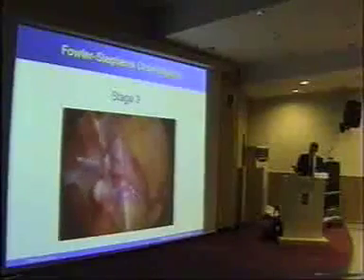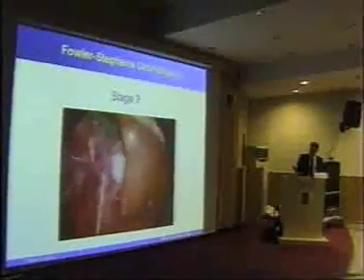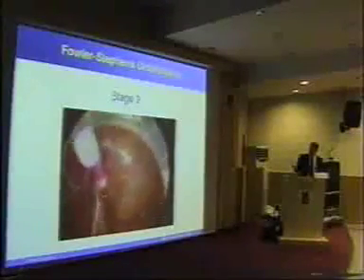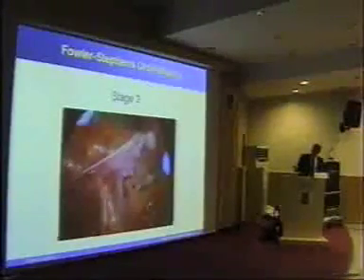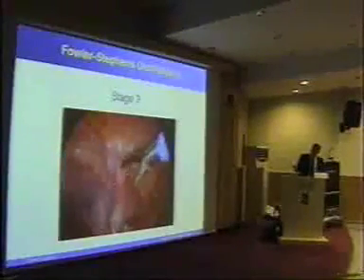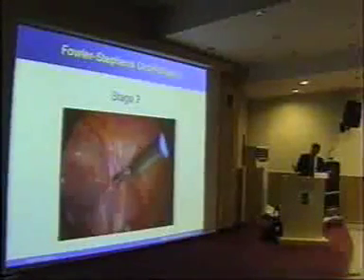So here's the same testis. Those are the 2 clips there. So we'll reach in and grab that, and we'll pull it medially. Don't forget this is on the right side, and laterally. And we can see now we're going to divide between those 2 clips. There's the vas running in here. You can just about see it. Little vessels with it. Testis is mobilized medially, and we're just dissecting down.